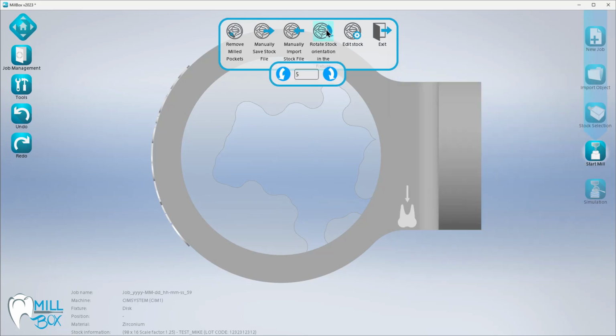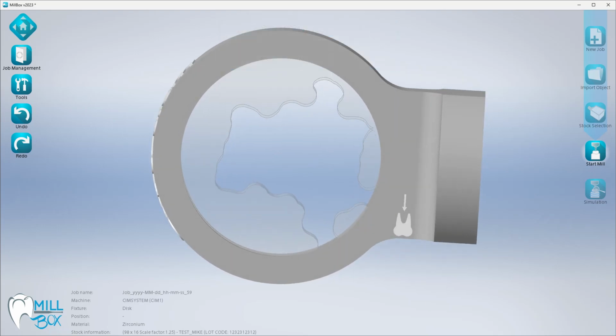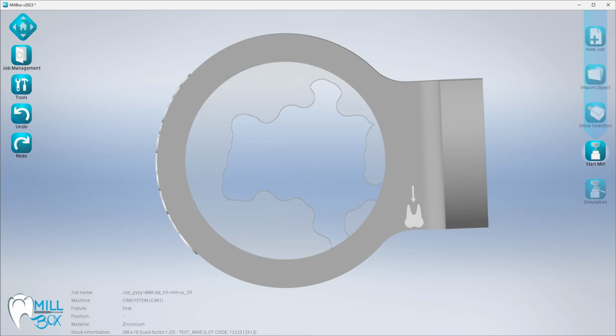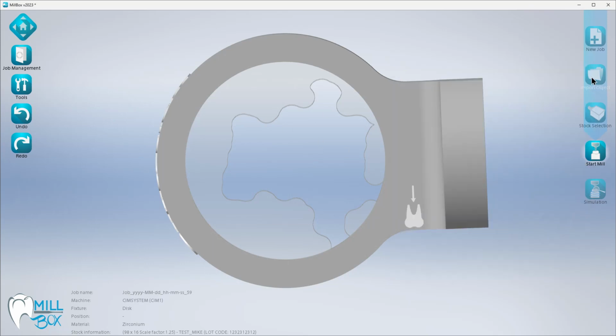If you need to rotate your orientation, you can. So you can go in and make some minute adjustments, kind of get everything in the right orientation, or at least as close as you think you can get there. Alright, and looks pretty close to our image. So at this point, I could go ahead and proceed with importing STL files in here, nesting those.